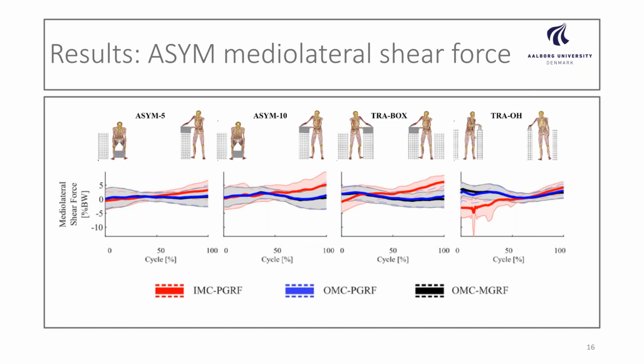And this is kind of the same problem we have here. And it may be that if these mediolateral shear forces are of a higher magnitude, then we would get a better agreement between the inertial motion capture model and the optical motion capture model with measured ground reaction forces. However, this is only speculative and would potentially need to be investigated if someone finds this is a very interesting parameter for their study.